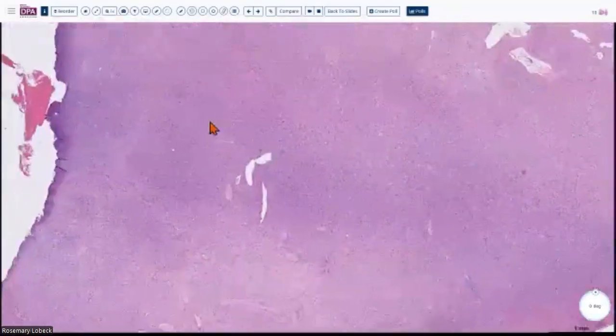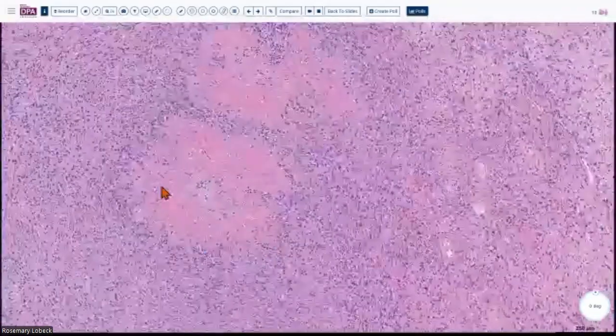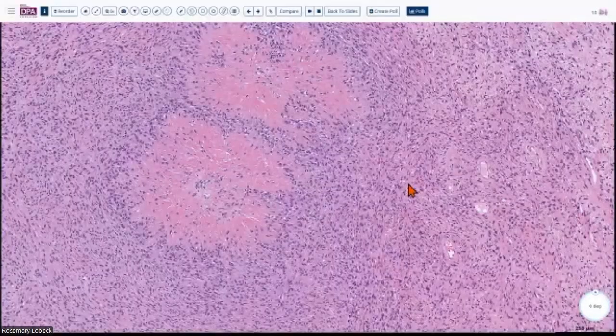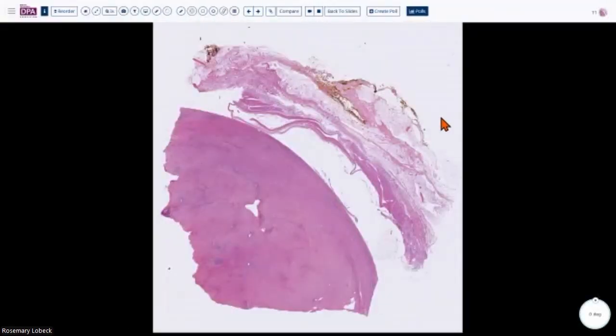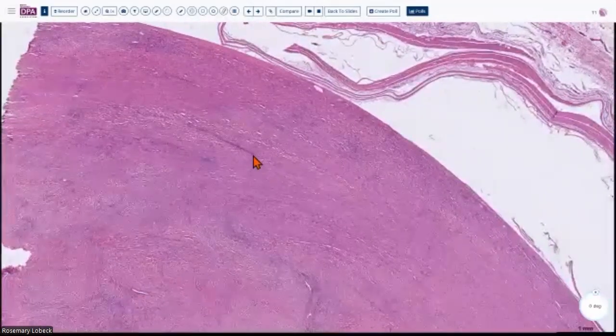And then the other feature I wanted to quickly point out here are these little pretty florets, right? These are called hyalinizing giant collagen rosettes. So this tumor was previously called spindle cell tumor with hyalinizing collagen rosettes. We don't use that name now because we know it's all part of low-grade fibromyxoid sarcoma. So the other sort of morphological variation with a slight genomic change is this lesion called sclerosing epithelioid fibrosarcoma, right?